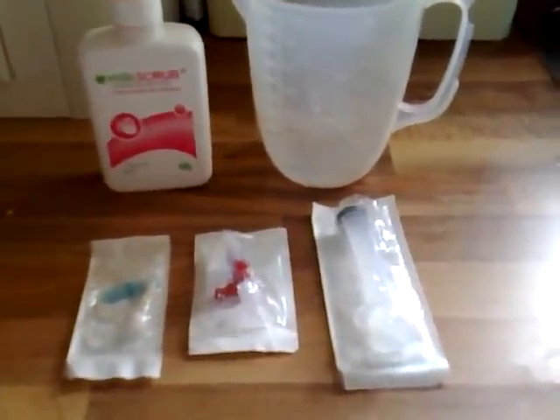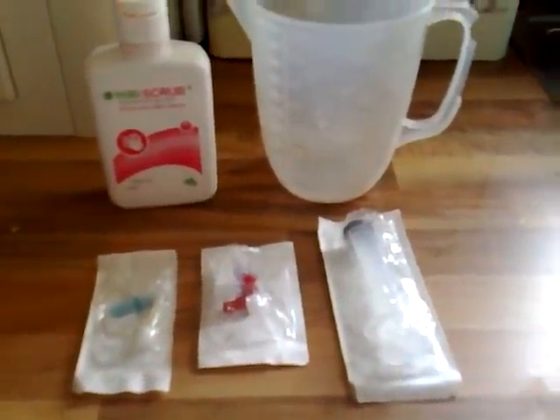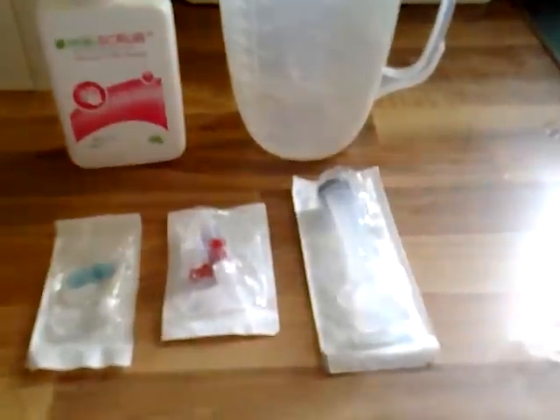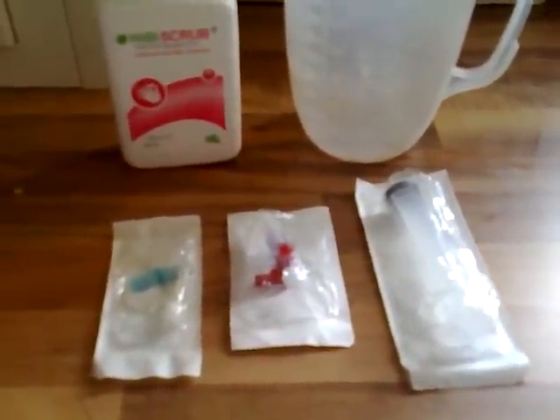You need to make sure you have your items ready. These include hibby scrub to prepare the skin, a jug to collect the fluid, a 20ml syringe, a three-way tap and a blue needle.